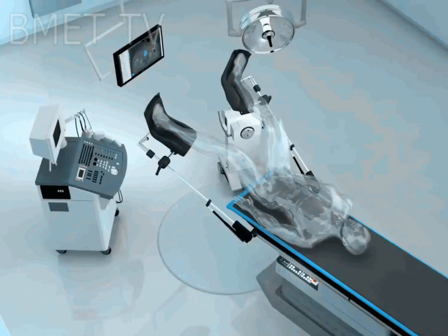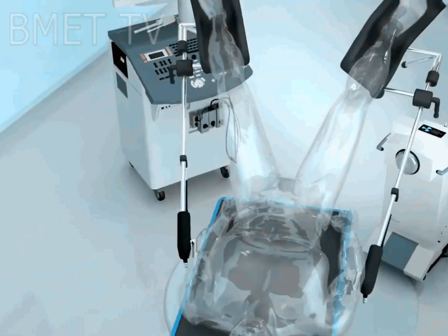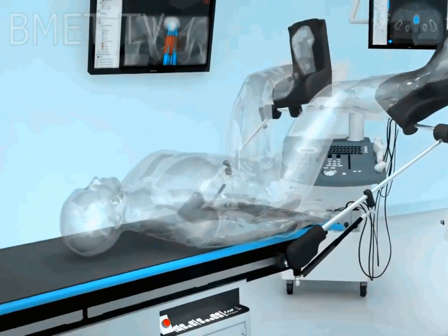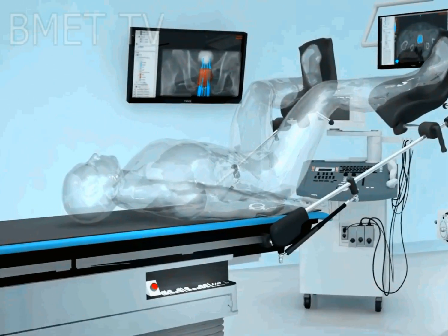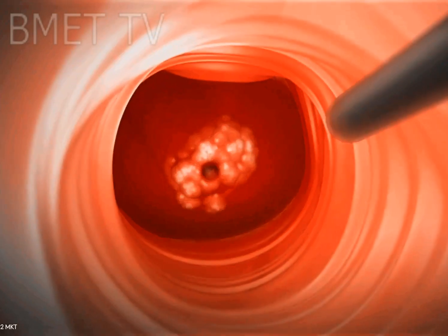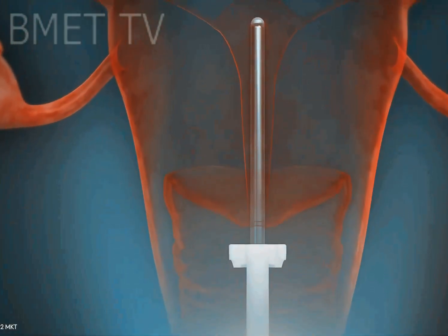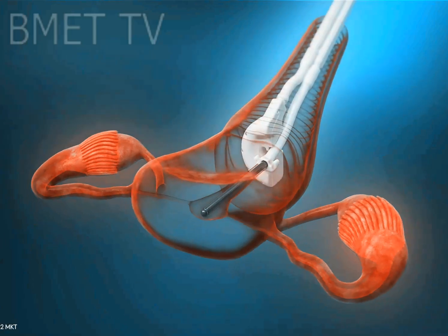High dose rate. HDR implants discharge high doses of radiation for 10 to 20 minutes. Your provider then removes the implant. Treatment times vary from twice a day for up to 5 days to once a week for up to 5 weeks. Permanent. Radioactive implants emit radiation 24/7 until there's no radiation left in them. The implants or seeds, which are about the size of a grain of rice, remain in your body. This treatment is also called seed implantation.